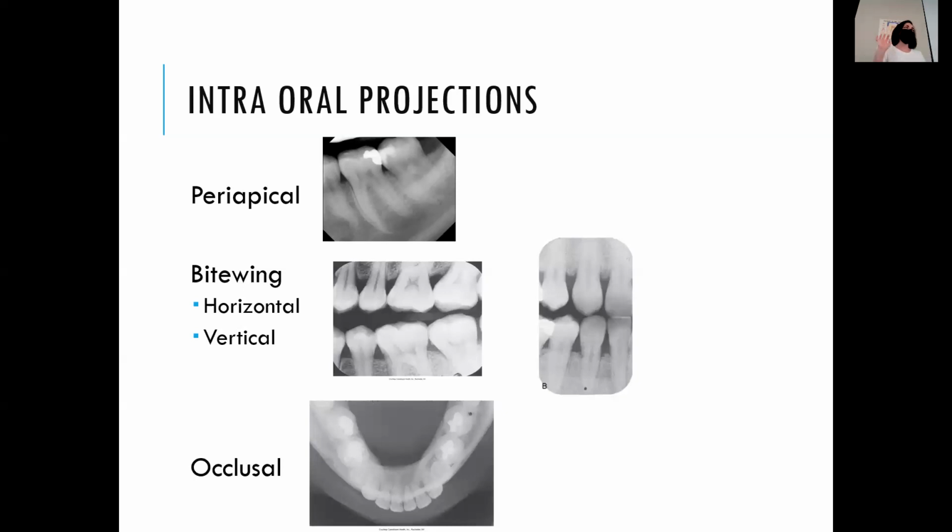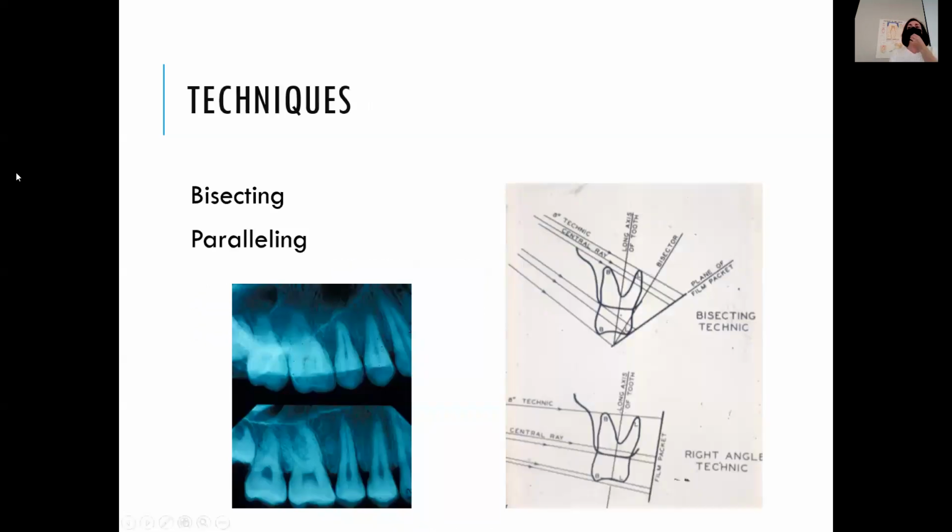It's a very short chapter, and we won't talk about that actually until I think the next block of lectures. And I think it's on like exam 3 or something. But that's another type of intraoral film, the occlusal. When we take x-rays, we're using 2 different techniques.